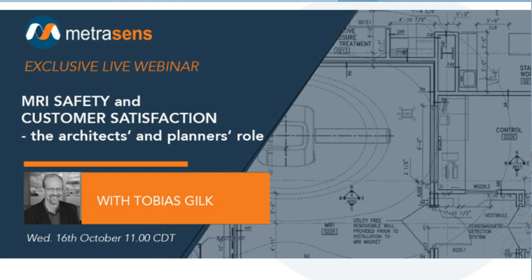Next one. Thoughts on scan room door locks? Electronic touchpads versus deadbolts versus proximity badge RFID technology? Door access becomes really complicated because it will typically involve both building codes and life safety codes, and then that has to integrate with whatever your safety or security plan is.